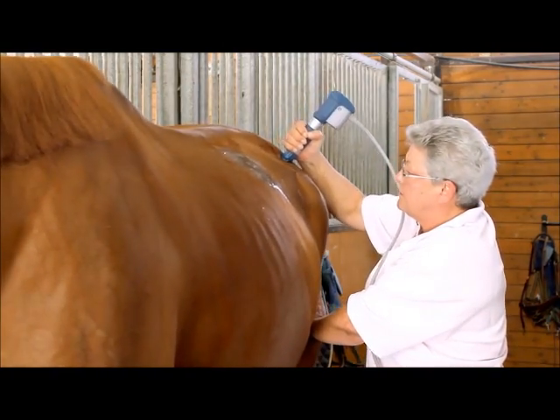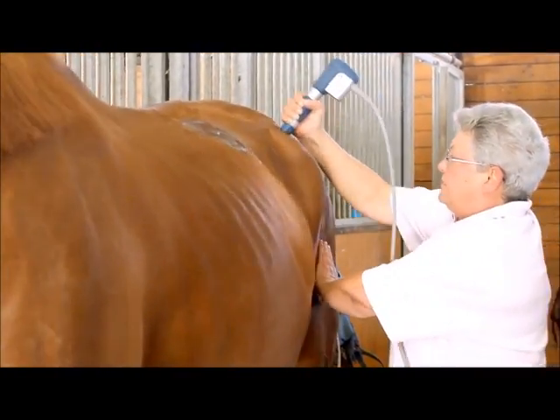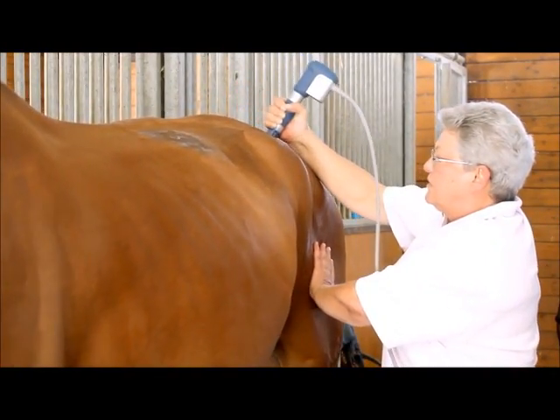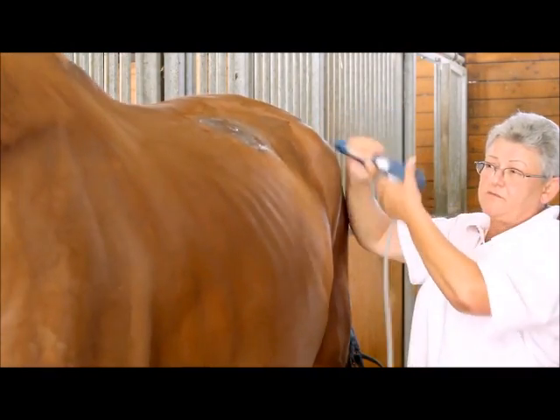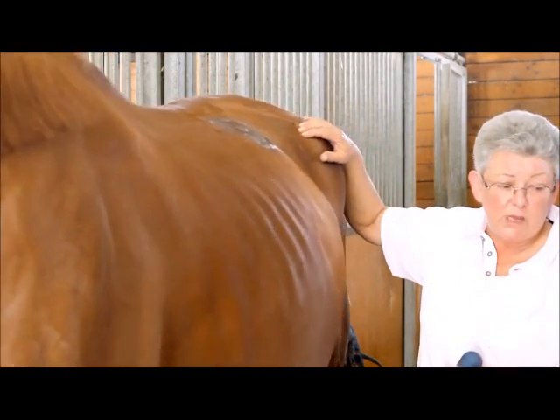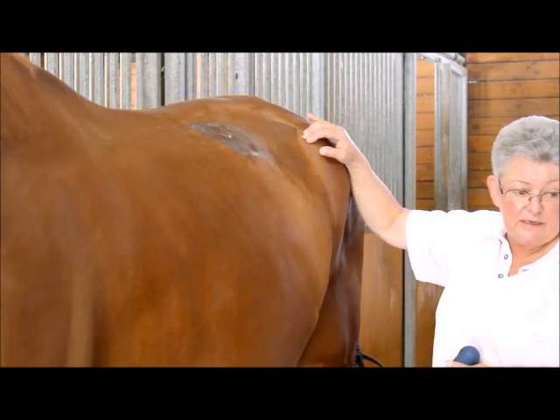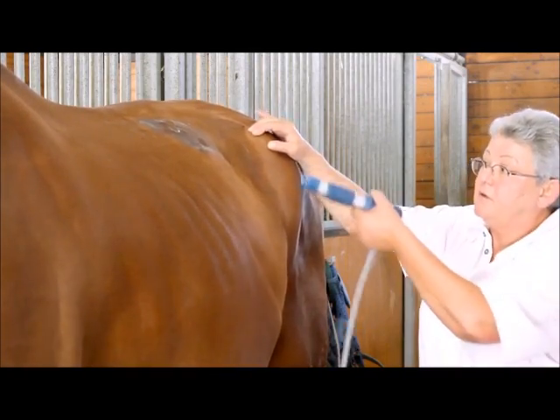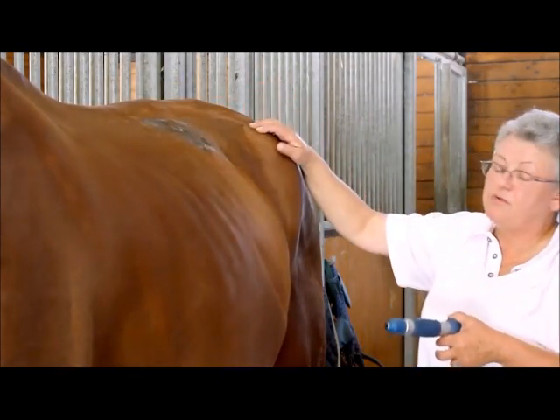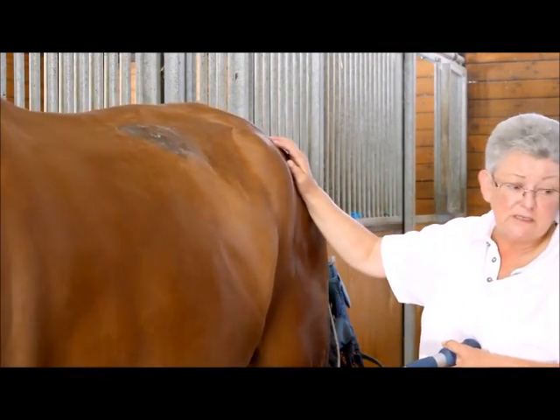Are you working over four bars? Normally not. And what is your frequency? About between 8 and 12. And the number of shocks — how many shocks? Now I have 3,300 with this part — about 2,000 on one area and 1,300 on the gluteal muscle.